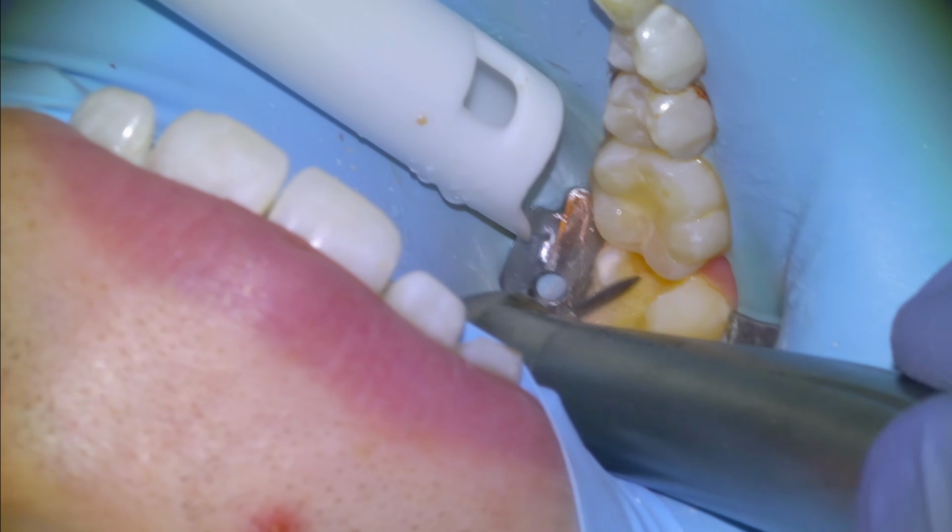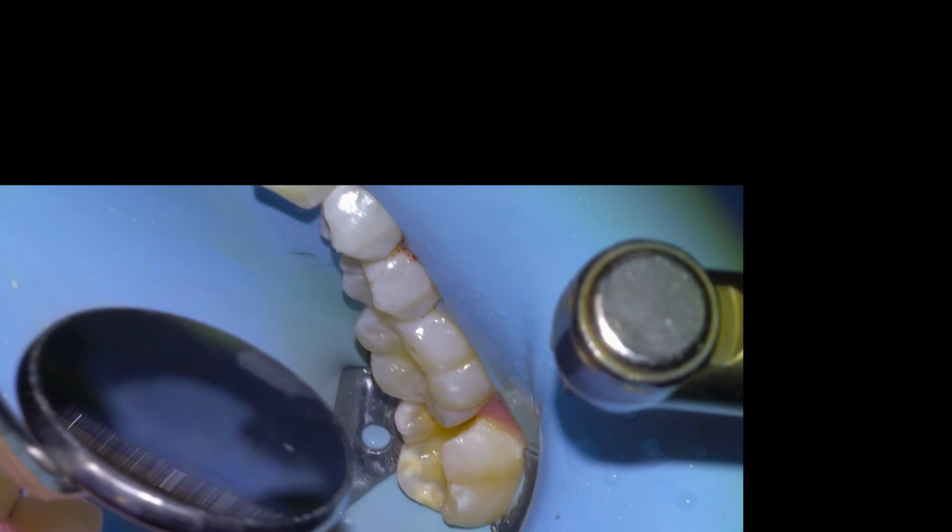And you can actually see an enamel chip just went flying off there. Sorry again about the formatting.